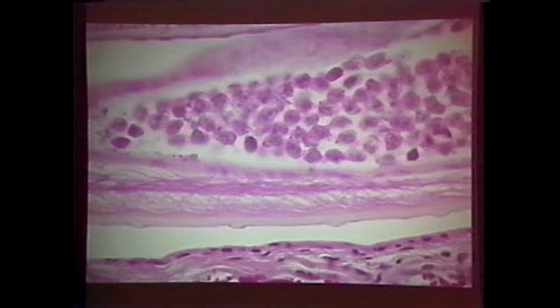In all the cases that we have, there are only 4, the adult worm is always associated with the eye. We have never had an autopsy on one of these dogs to know if there are nodules or worms elsewhere. There's one more thing that we would like to know: of course, there are males and females, because this female is filled with sperm, and they also have microfilariae inside the uterus.